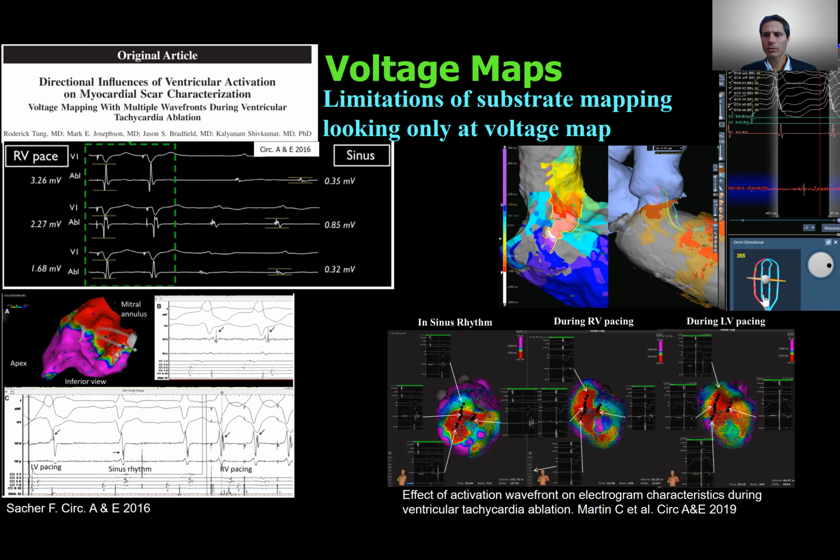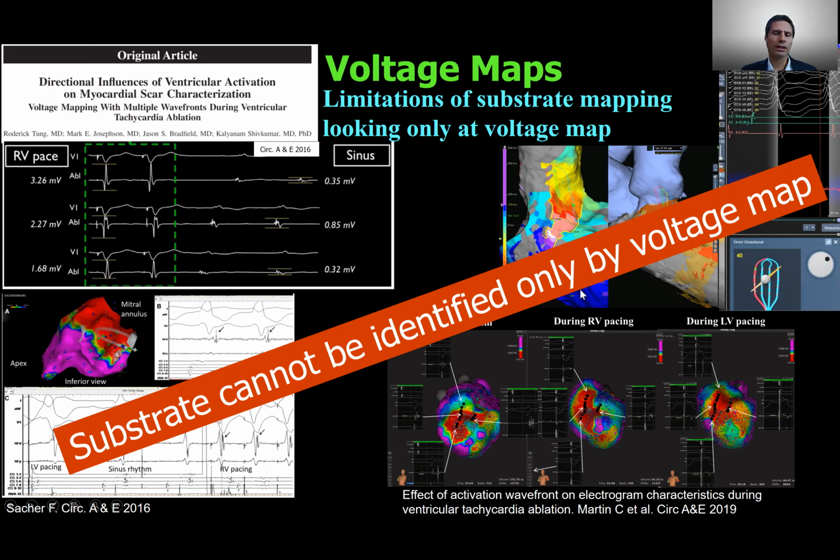There are also some things that have been very well known for decades, which is the bipolar orientation compared to the activation wavefront. In this case, if you are parallel to the grid, to the HD grid, the signal is pretty well seen. Whereas if you record the signals in a bipolar perpendicular, in this case, you can miss the signals. There are many other parameters, such as fat, contact, electrode size and interspace, fiber orientation.